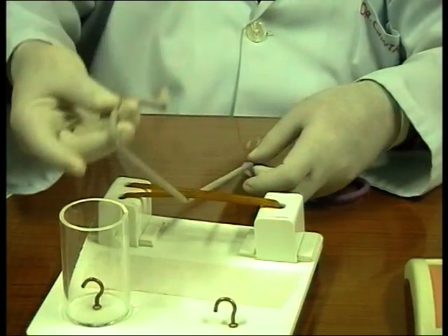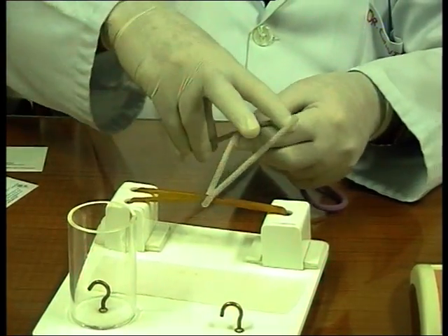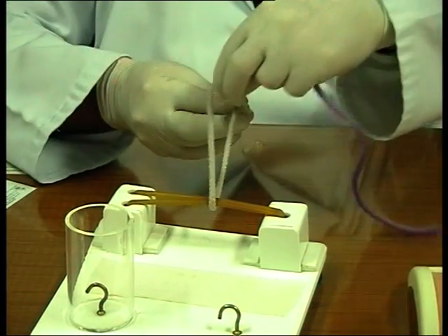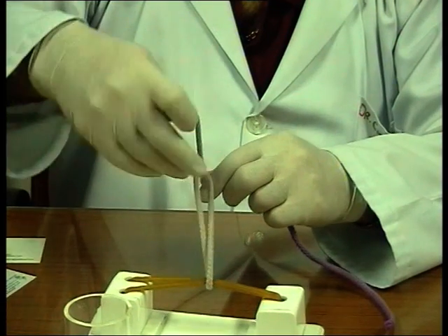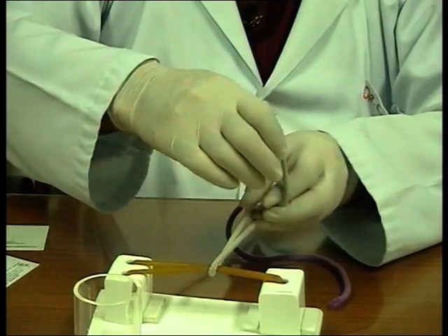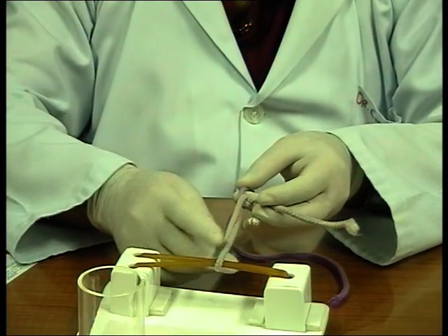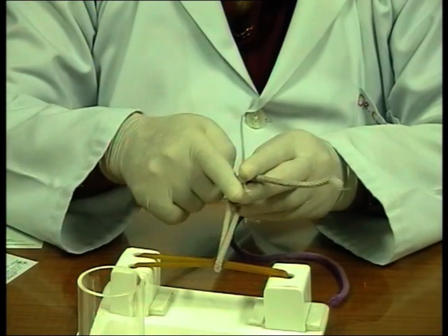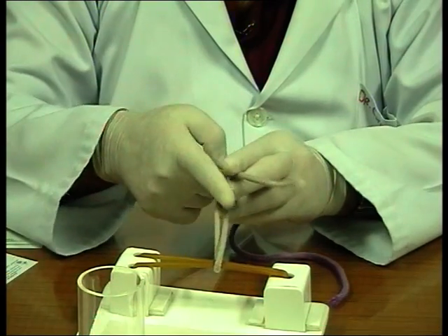The short end is away, long end is towards you. Now what should I normally do? Put a figure of 4, take the throw out and cross. But I don't cross. And I don't take it down completely. If you notice, the problem here is the threads have already crossed, even though I have not put a throw. So they will cut each other by what is called the bowstring effect of threads. Threads cut each other and the tissue will be free.